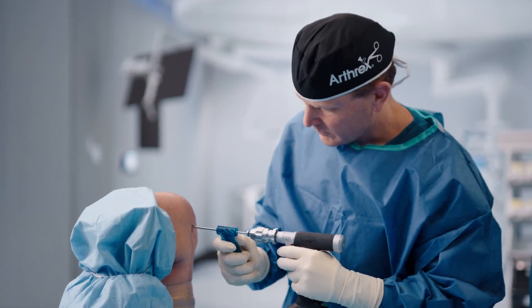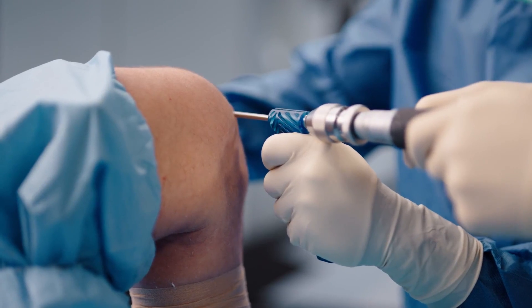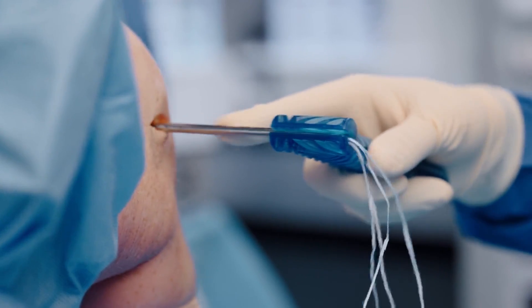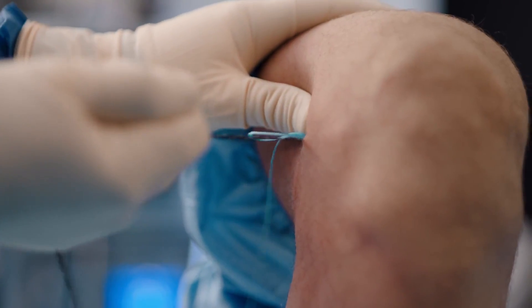You're able to complete your repair or reconstruction within seconds and you can rely on that reconstruction or repair, then go back and re-tension it if needed. We now have a faster and more reproducible way to do our repairs and reconstructions, specifically in the knee.